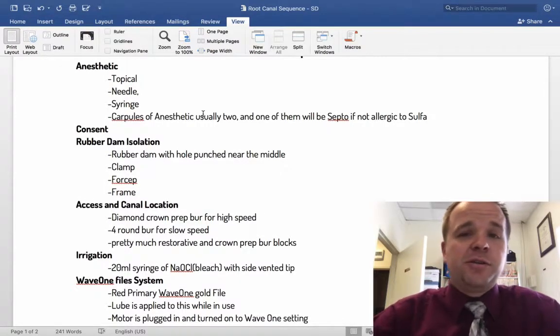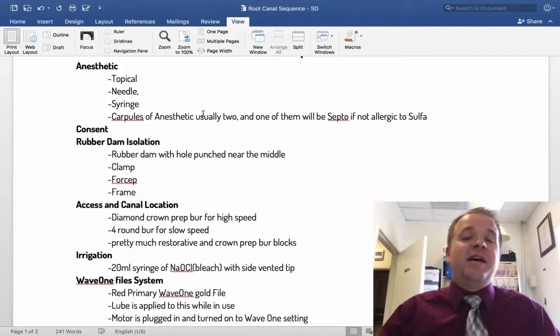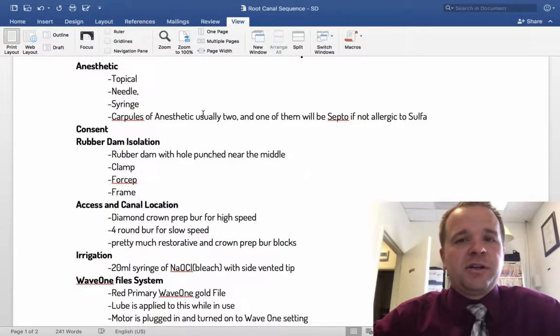First thing you'll do is explain to the patient, hey, this is what we're going to be doing today. Make sure that you're all on the same page, and then you're going to start doing anesthetic. So the first thing you'll do is topical anesthetic just to make sure they're in good shape. You'll do the needle. Remember what color was long and what color was short? That's right, yellow's long and blue's short.